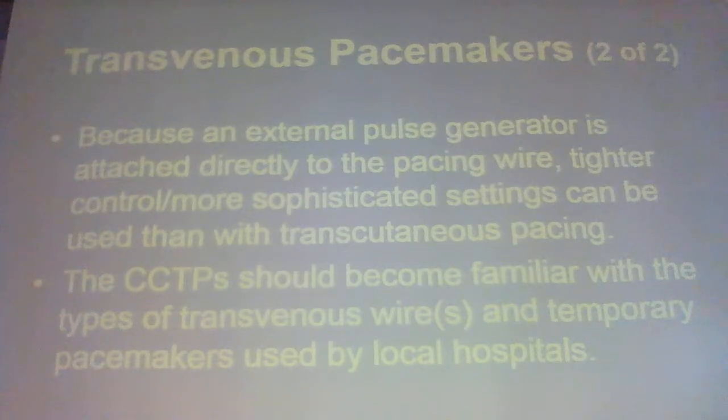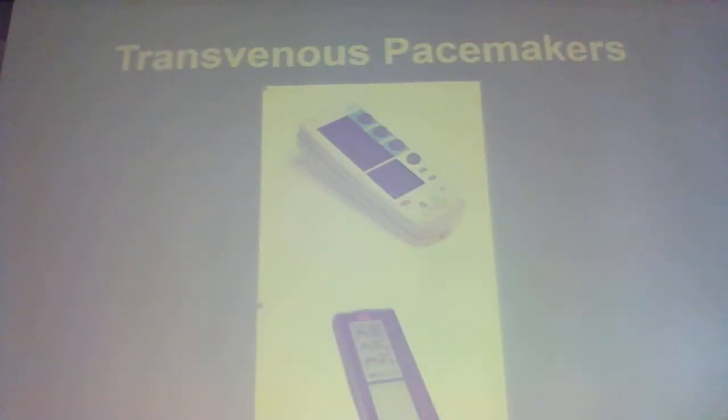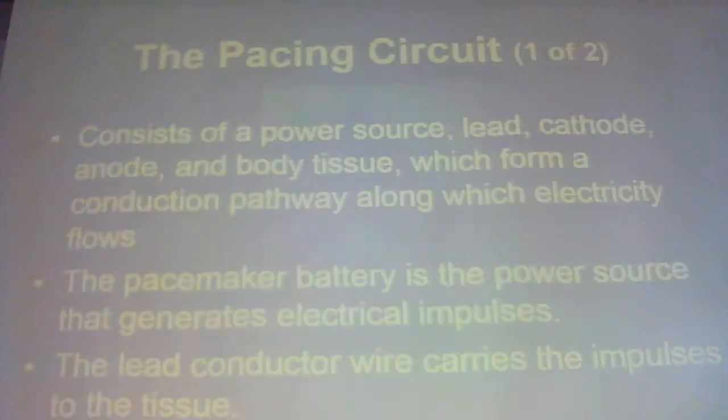All right, what's a transvenous pacer? They float pacer wires through like your subclavian, get it into the right part of the heart, and just keep it stimulated that way until they can go in and put the permanent pacemaker in. So that's what they usually do in the ER, is float a pacer under fluoroscopy or sono or something. So that's what it looks like. Just turn up your milliamps, turn up your rate.